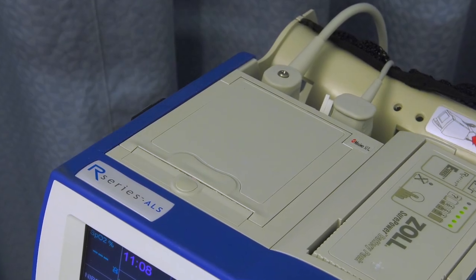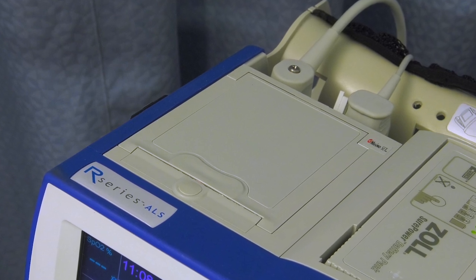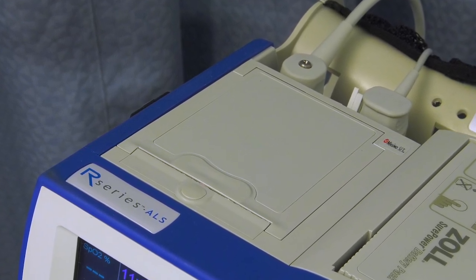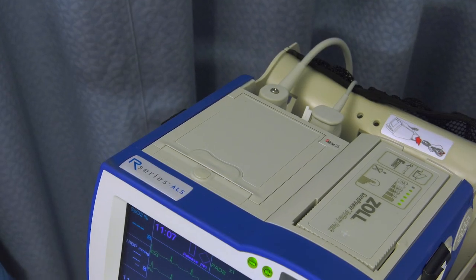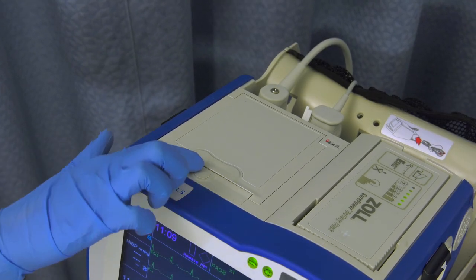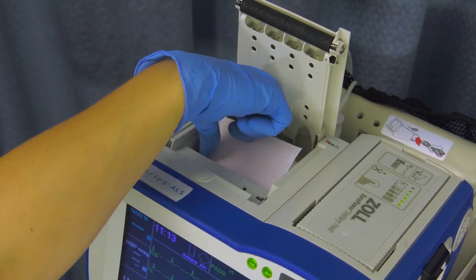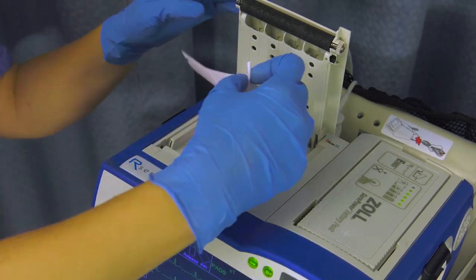The R Series includes a number of functions that make it easy to use and ensure that the device is always ready. The strip chart recorder is located on the top of the defibrillator. You can easily change the paper by pressing on the recorder release latch to open the compartment, remove the old paper, and drop in a new pad with the folded corner on top.